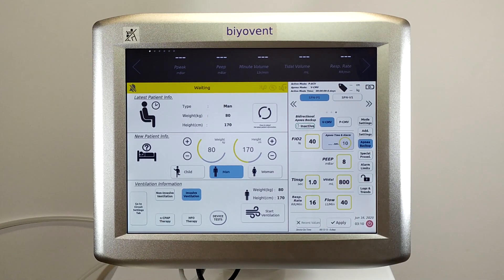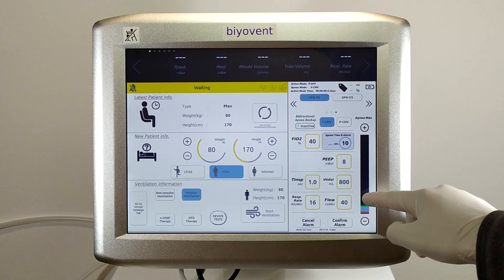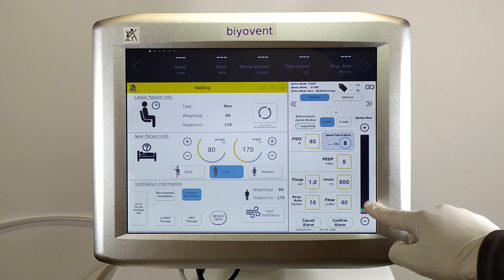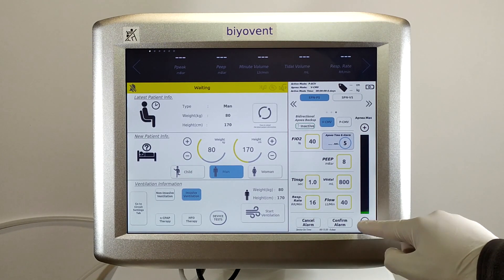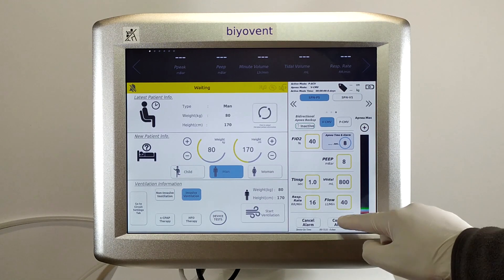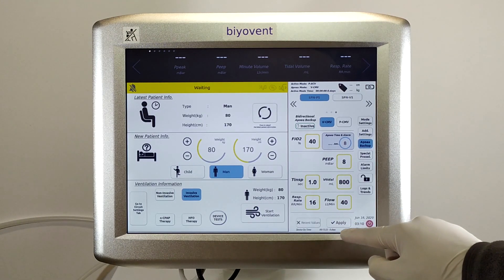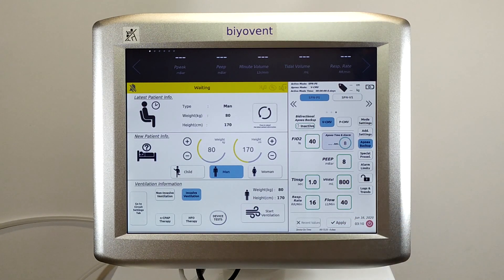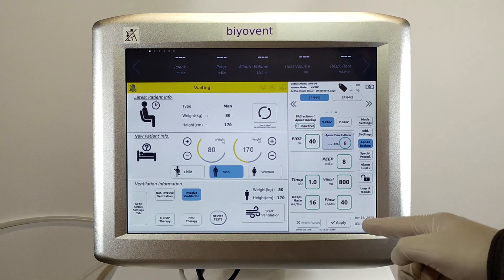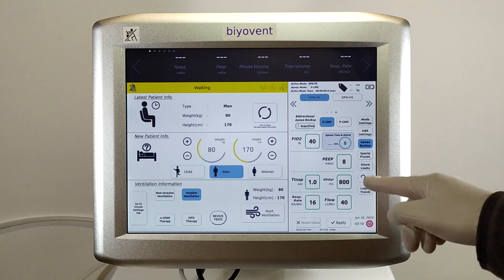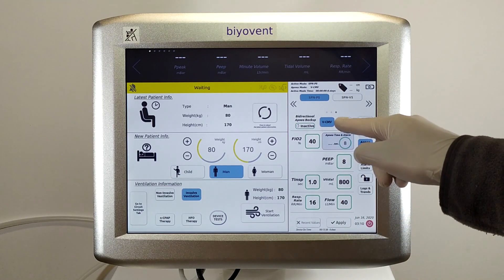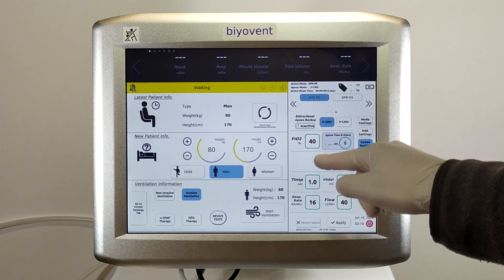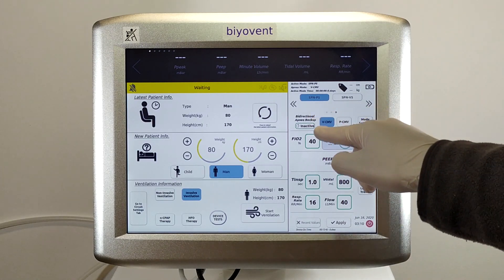When adjusting these settings, you must define a time period along with other parameters. In spontaneous modes, if the patient does not trigger ventilation during this time, the ventilator will automatically switch to apnea mode. There are two types of apnea modes: pressure control and volume control. You can select these modes from there.